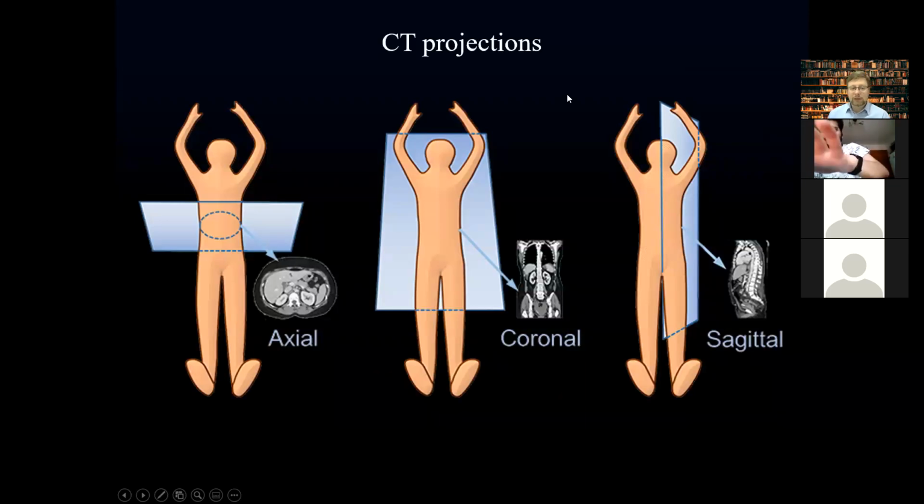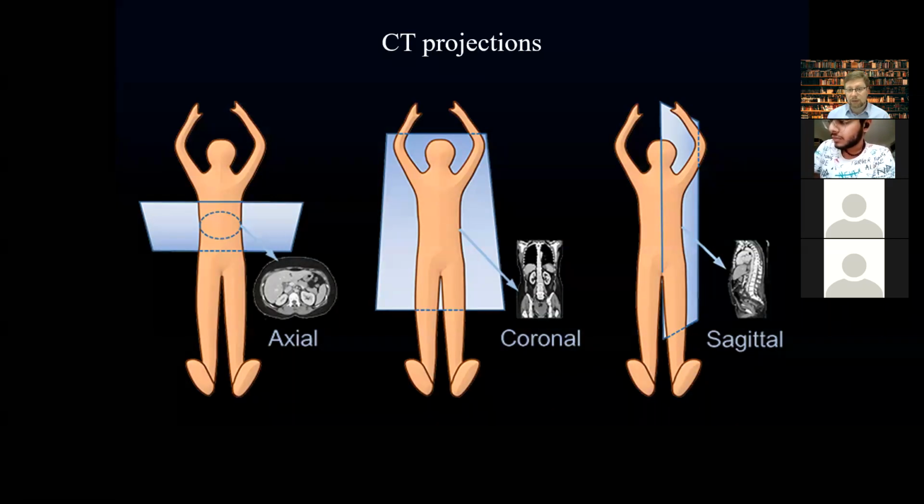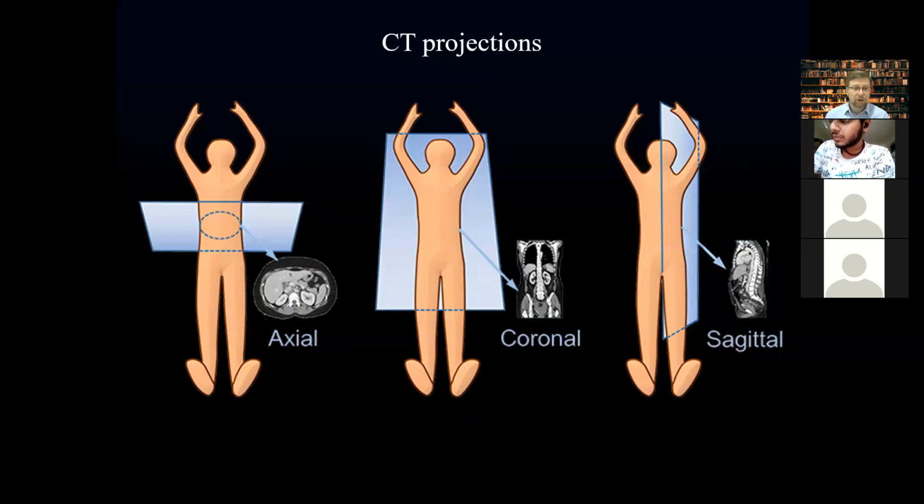Very important to understand the projections. Usually we perform imaging in 3 projections, but sometimes, due to the ionizing radiation that the patient will be exposed to during each projection that is applied, we may decrease the number of projections.